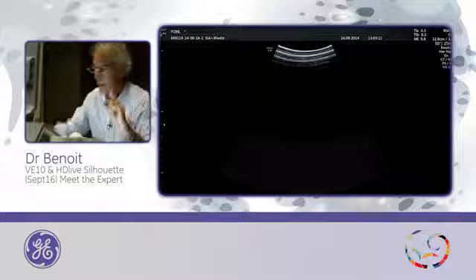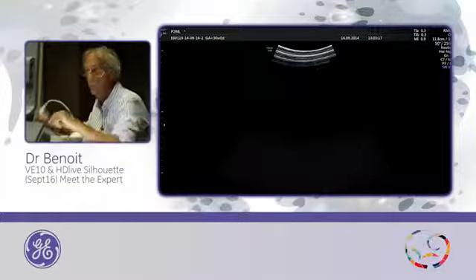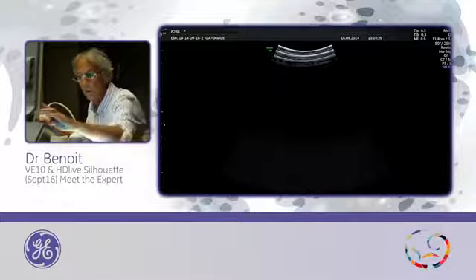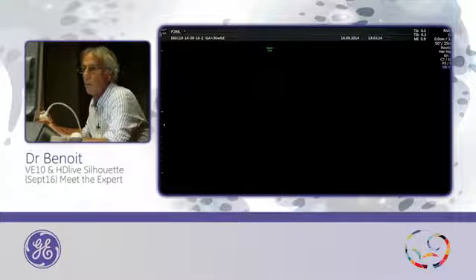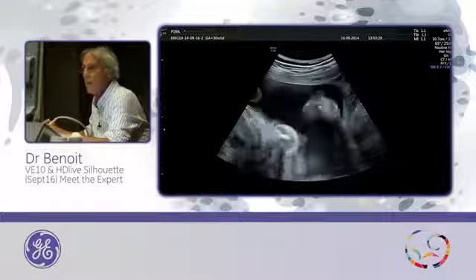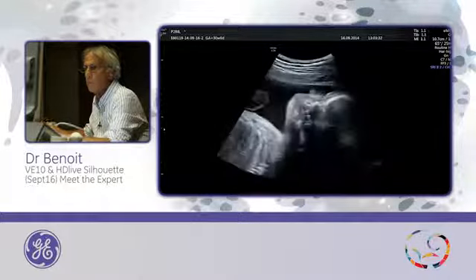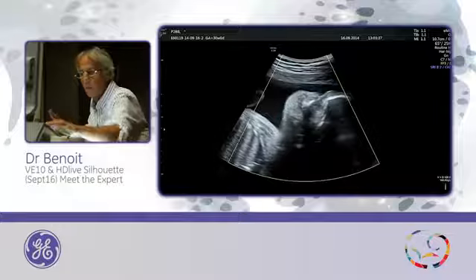Because the baby is moving, I will use a 4D, and this is really the main advantage of the electronic probe, because you can have a really fast 4D. So I will do it 4D, face.